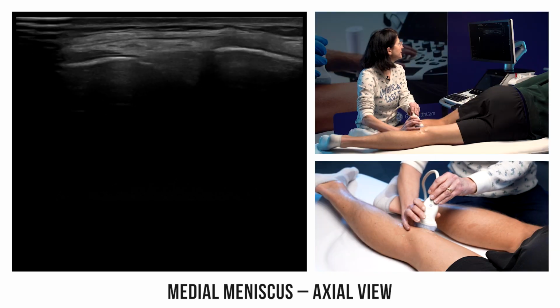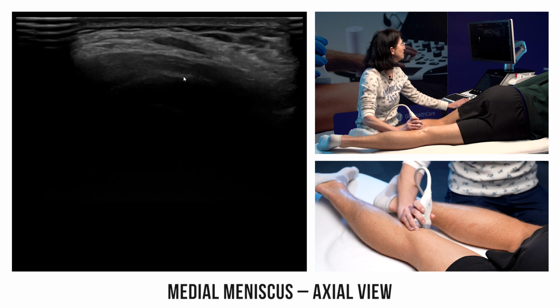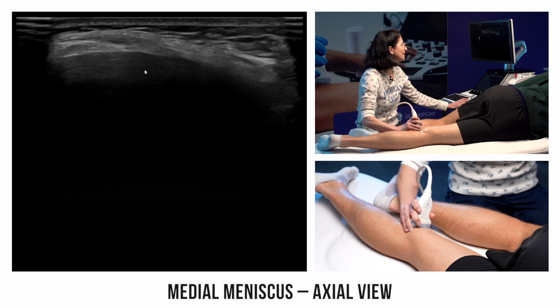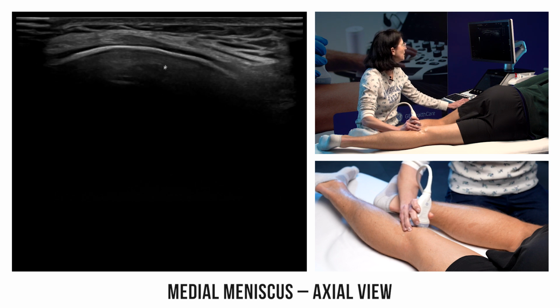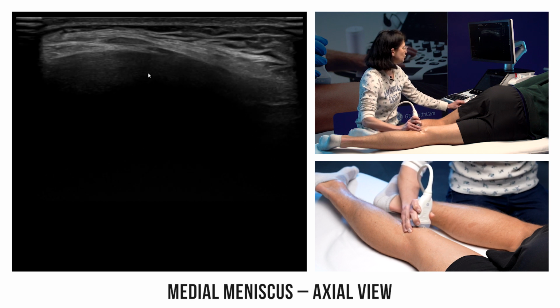The medial meniscus can also be examined in the transverse plane, even if it's slightly less informative. We rotate the probe 90 degrees. Above, we are here on the femoral cortex. Once we slide the probe downward, we're in the meniscus plane, which appears relatively hypoechoic. Then we go even lower down to the tibial plateau plane.